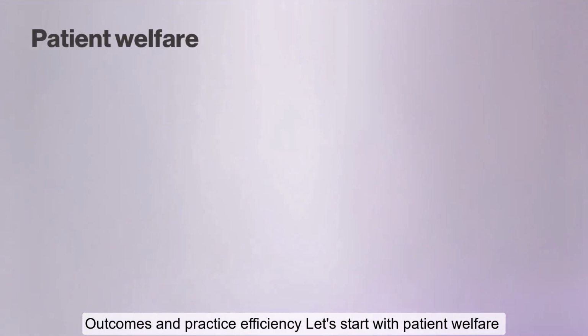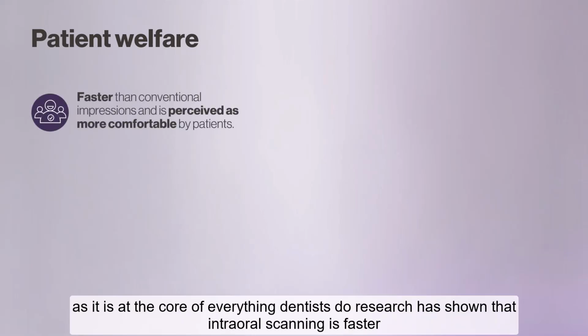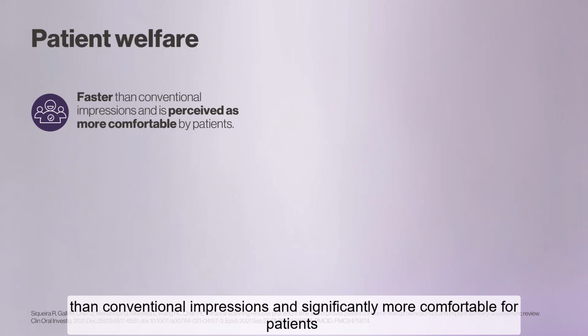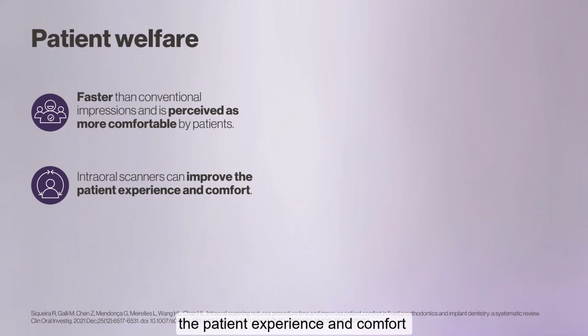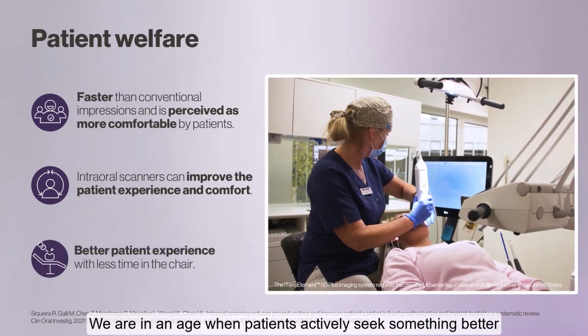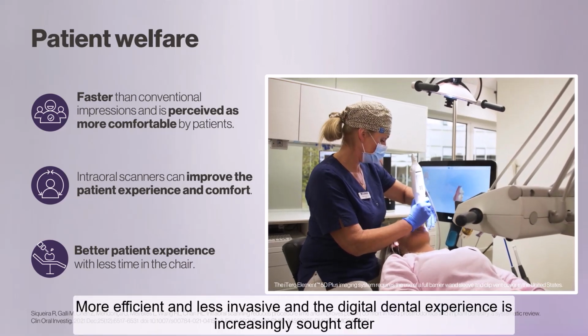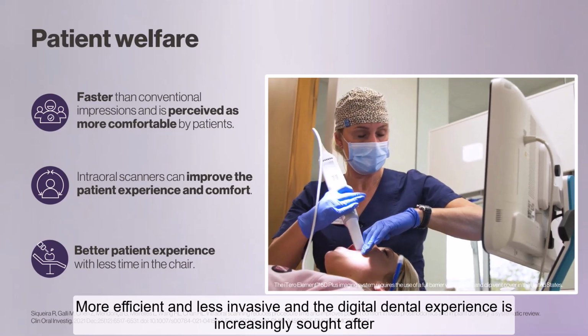Let's start with patient welfare, as it is at the core of everything dentists do. Research has shown that intraoral scanning is faster than conventional impressions and significantly more comfortable for patients. A recent meta-analysis analyzed 11 studies on patient-reported outcomes and concluded that intraoral scanners can improve the patient experience and comfort. We are in an age when patients actively seek something better, more efficient, and less invasive, and the digital dental experience is increasingly sought after.